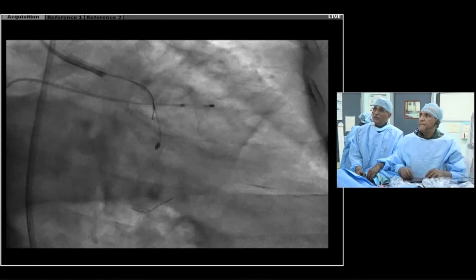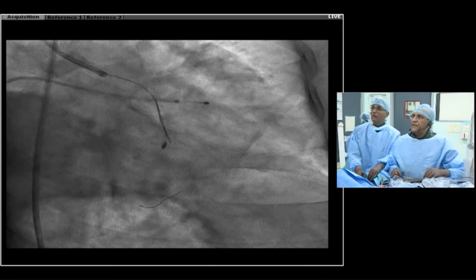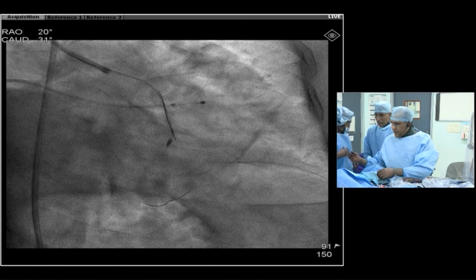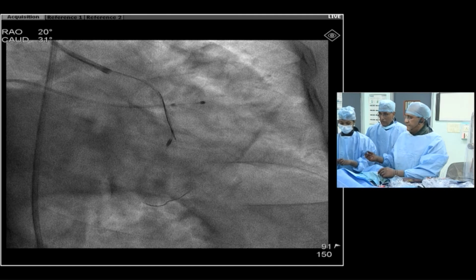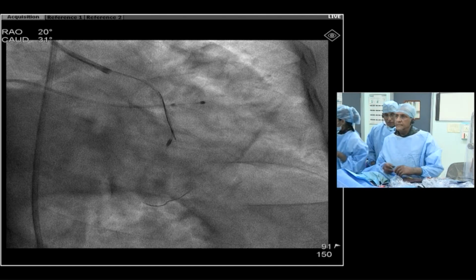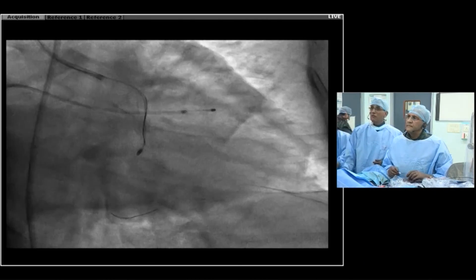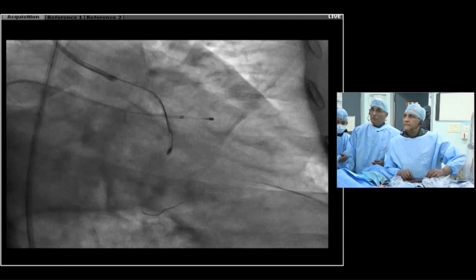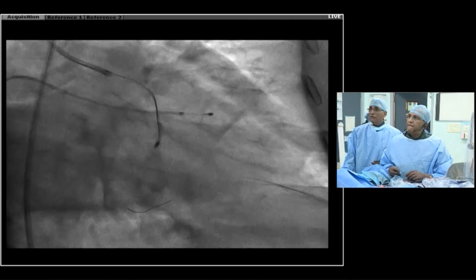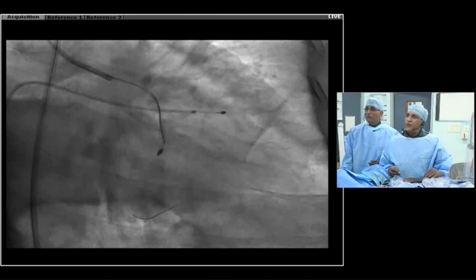Where is the microcatheter? Right there. Can you see that? Yeah, fine. Now give me a UB3. Give me a torquer. So I think go ahead with a microcatheter to the burr, and then probably you need to use some CTO wire. Exactly, we're doing that. So what's the wire you're using, Kirti? I'm going to go with a UB3.